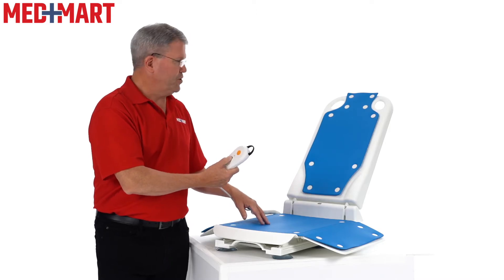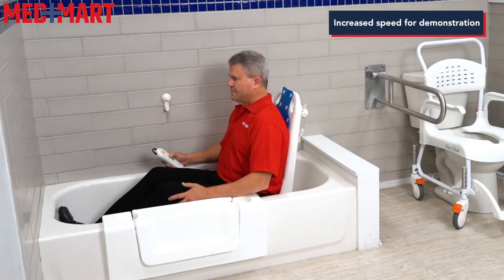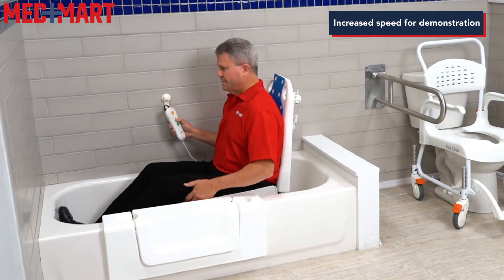When you're ready to bring it back up, just push the up button. The back will come up at the same time and then it will go ahead and raise up.